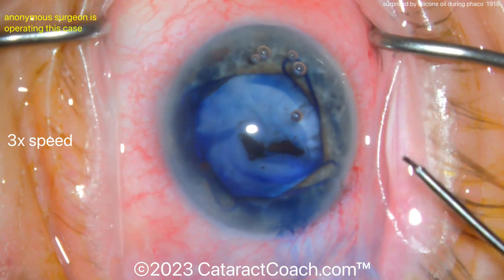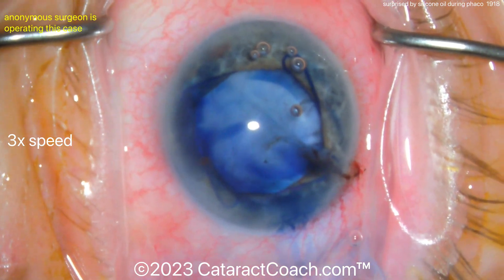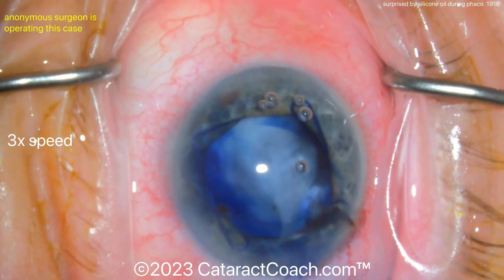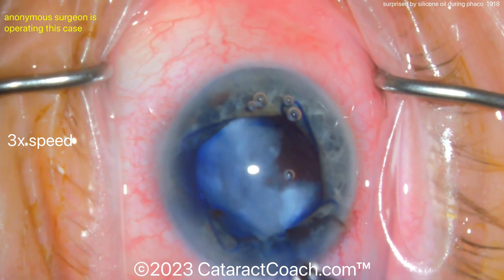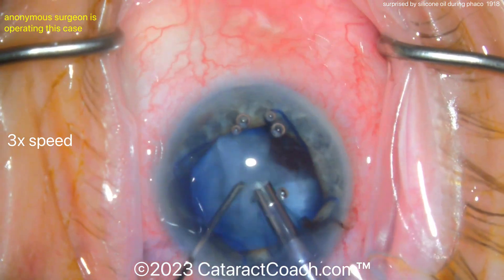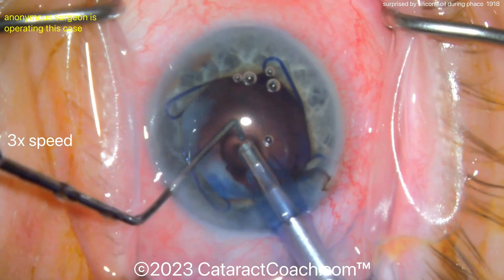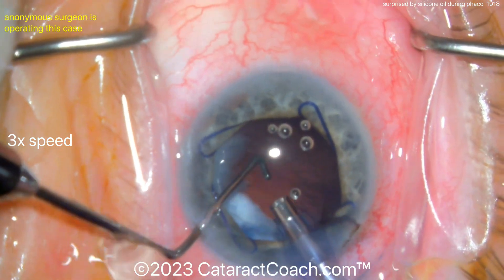Our anonymous surgeon does a great job with the capsulorhexis — trypan blue dye staining was accomplished. When you put the phaco probe in the eye, it's going to be basically an empty bag. Trying to stir it up — it's just fluffy cortex. Where's the nucleus? The nucleus has already fallen into the back of the eye. There is a big opening in the posterior capsule. The nucleus is already gone.